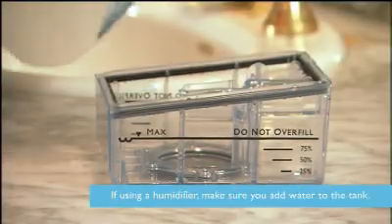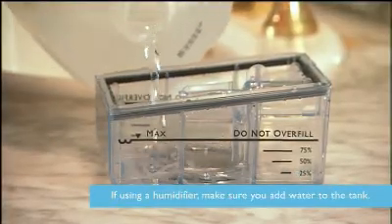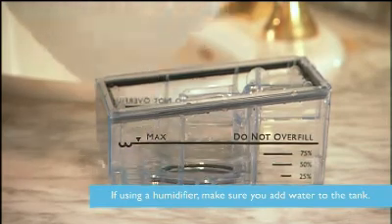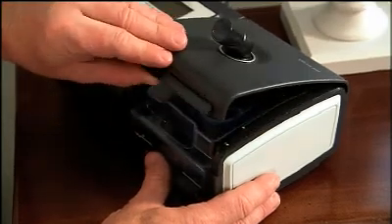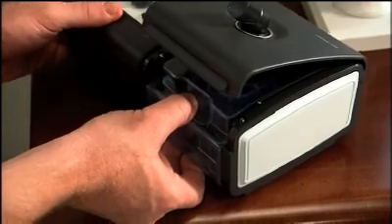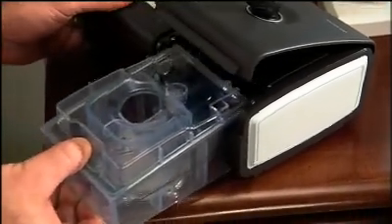If you have a humidifier, remember to make sure that there is water in its water tank before you turn on the device. To do this, lift the humidifier door up until it locks into place. Never force the door higher. Grasp the front of the water tank and slide it toward you.